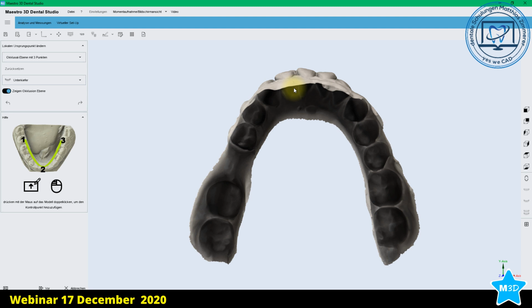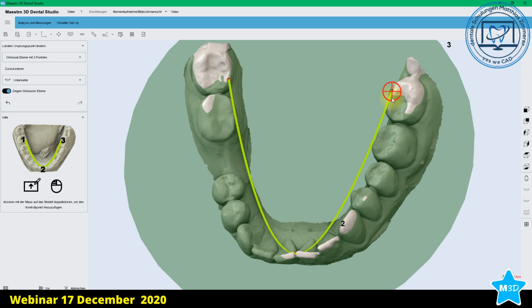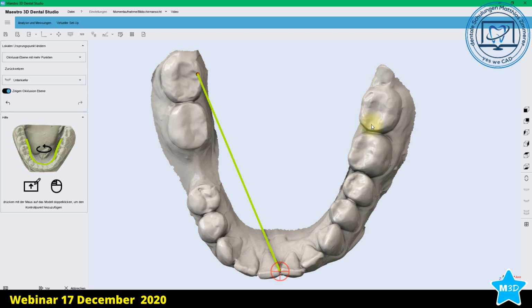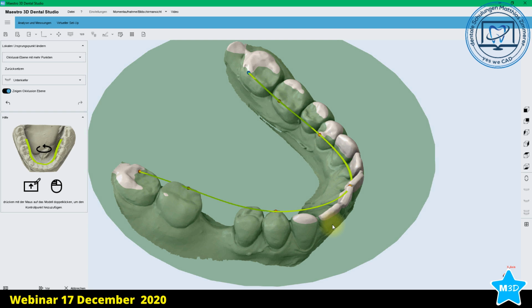First, we have to set up the occlusion. This is possible with a 3-point area, and also with more than 3 points, normally 6 points. It's possible to do it this way, but it would probably be better to set the points one after another, and then you can set new points between. More work for you, but I don't think it gives a better result.